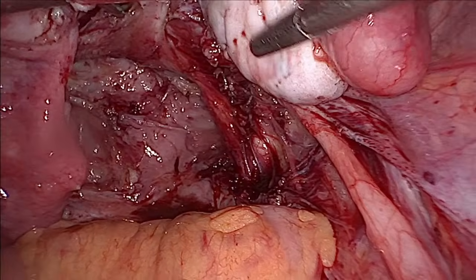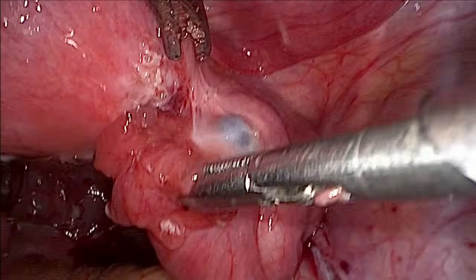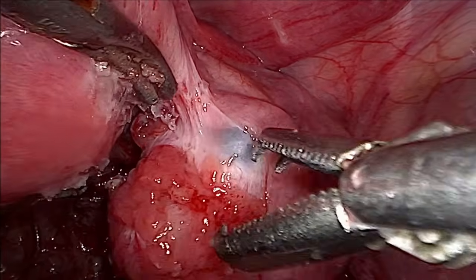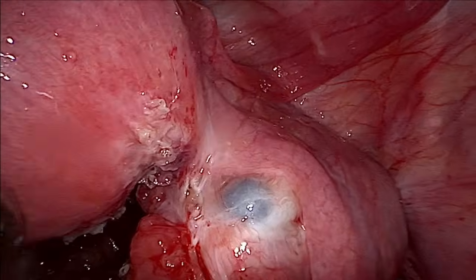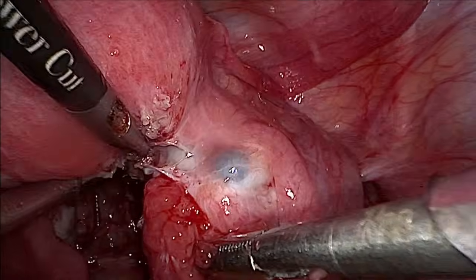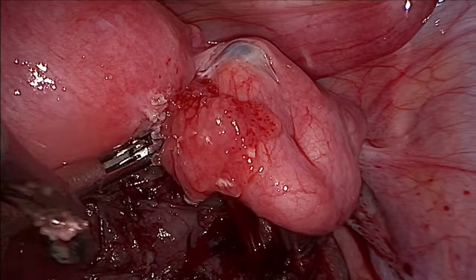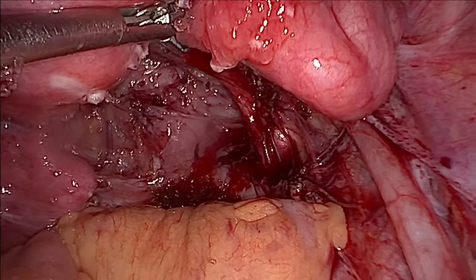Now once this has been done, back to the fallopian tube. I would like to switch my grip to a bipolar. Okay, it's an atraumatic instrument.